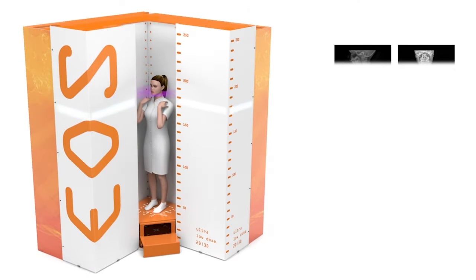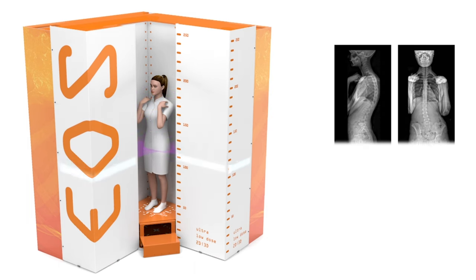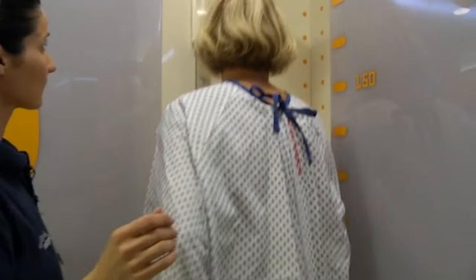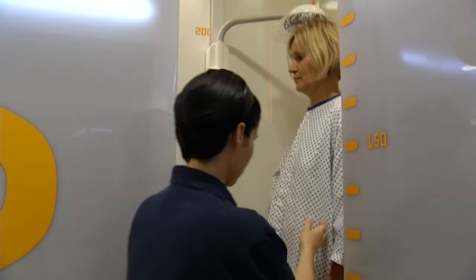The examination itself usually takes about 20 seconds. Both the frontal and the side x-ray are taken simultaneously, which dramatically shortens the exam time. It's pretty easy to use — as you can see here, it's basically kind of like a shower stall; you just stand in there, hold still, and they do the image.